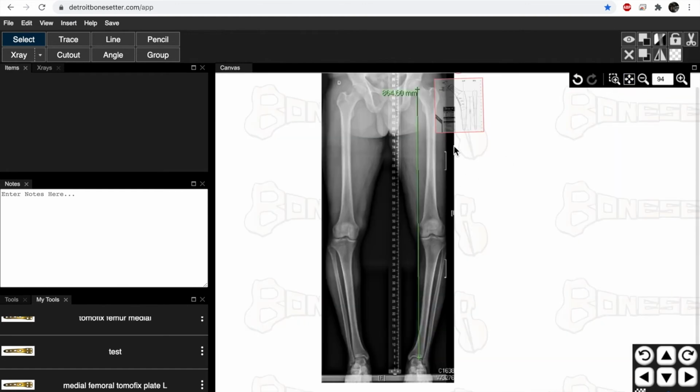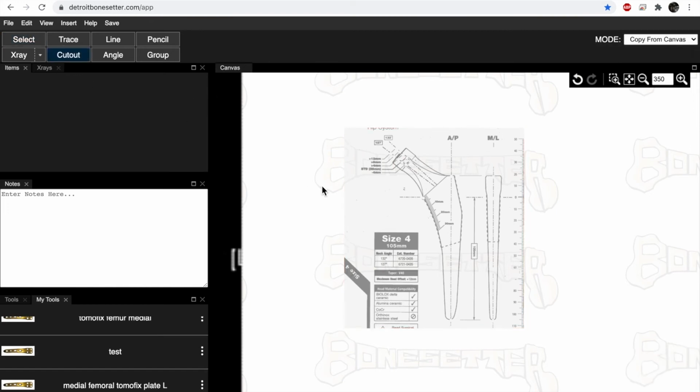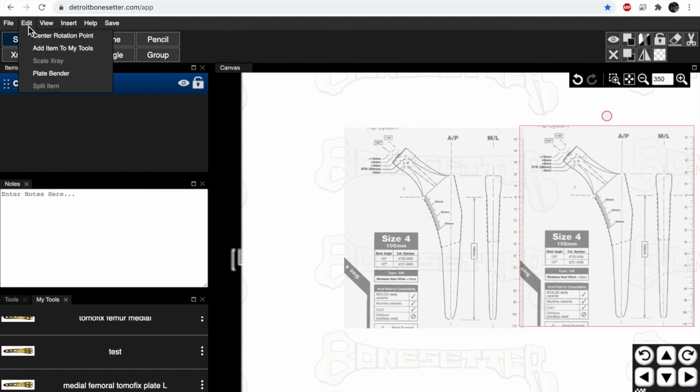Now there's only one issue. You can't save the X-ray. You have to do a cutout, okay? So it's just one of those funny things. And then what I'm going to do is I'm going to do a cutout in the transparency. So I could do the whole thing if you want. I can do this to this, to this, to this, to this. And now this is a cutout, and I can save, edit, add to my tools.